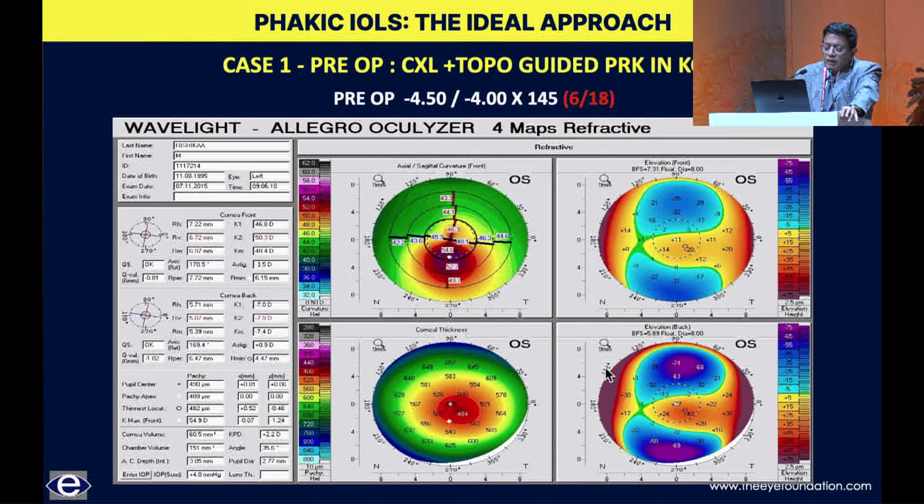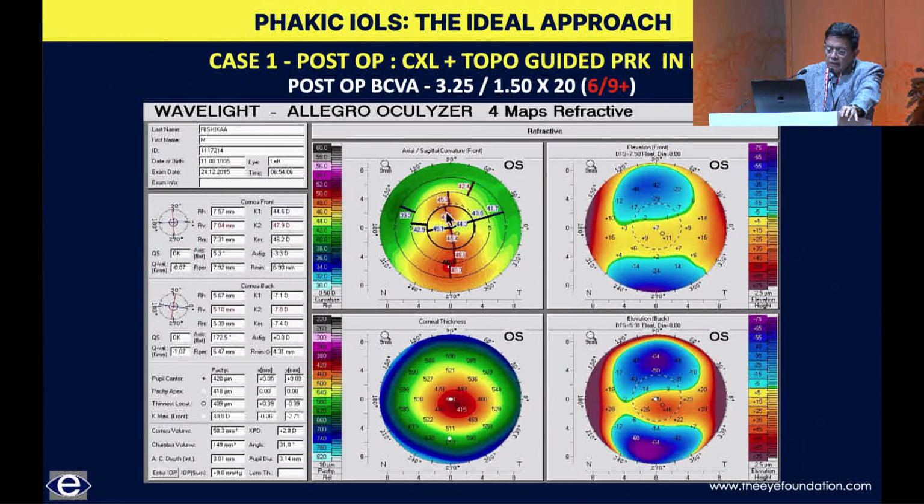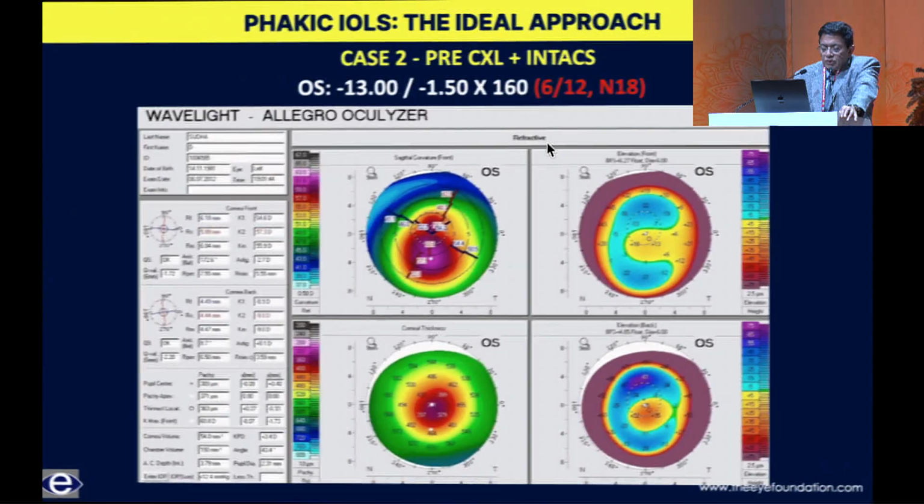Just in case the coning is not so extreme, but still it is somewhat decentered, you can see over here, I would like to center this here, as Chitra was alluding to earlier. You can do a collagen cross-linking with the topo-guided PRK, and once this gets, you can see the significant, it's almost a regular with-the-rule bow tie that you have here. And most importantly, the best corrected visual acuity from 6/18 has improved to 6/9 plus. So this eye is now ready to be rehabilitated with a phakic intraocular lens.